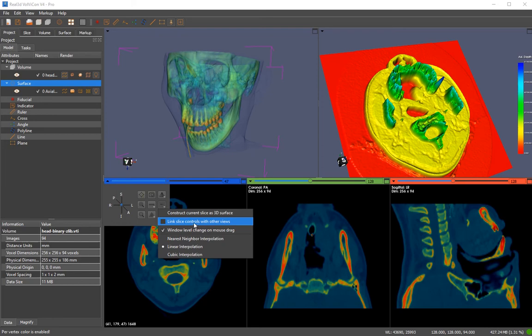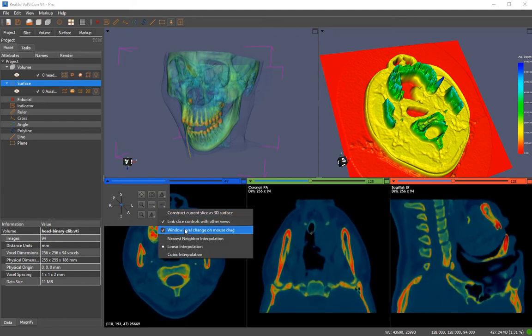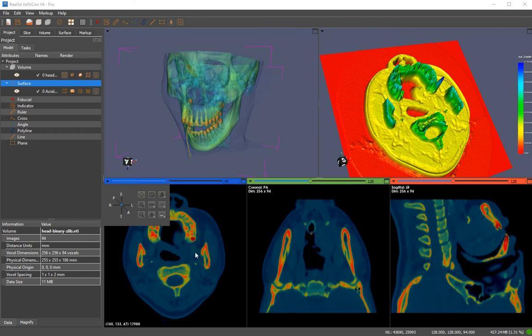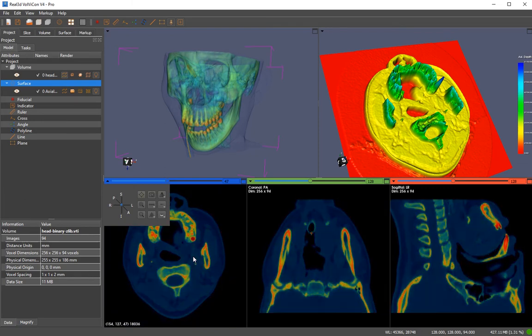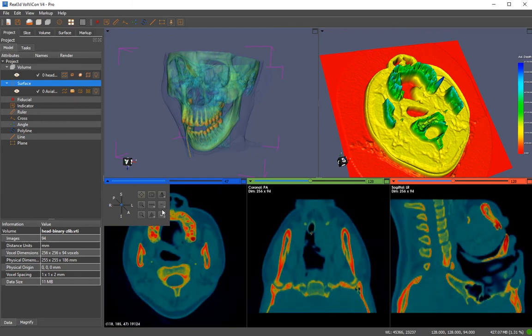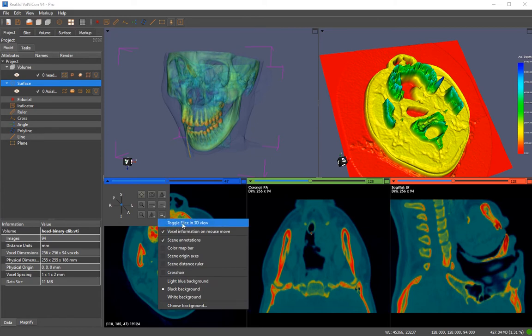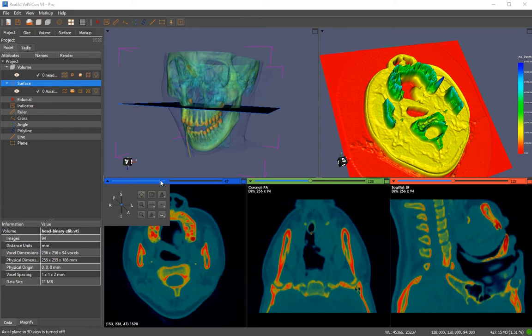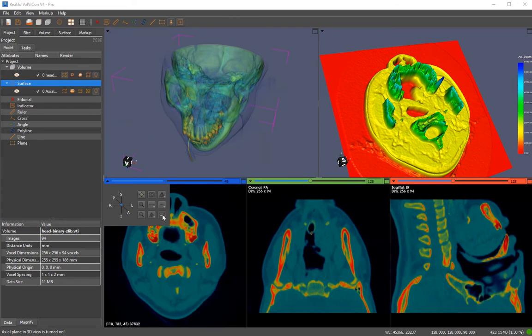You can link controls with other views. Let's link it — now all views' cameras are linked. You can enable or disable window leveling on mouse track. If I hold the left mouse button and drag with window leveling disabled you see no change, but if I enable it you can change the window level. There is also interpolation for slices, and you can toggle a slice in the 3D view.